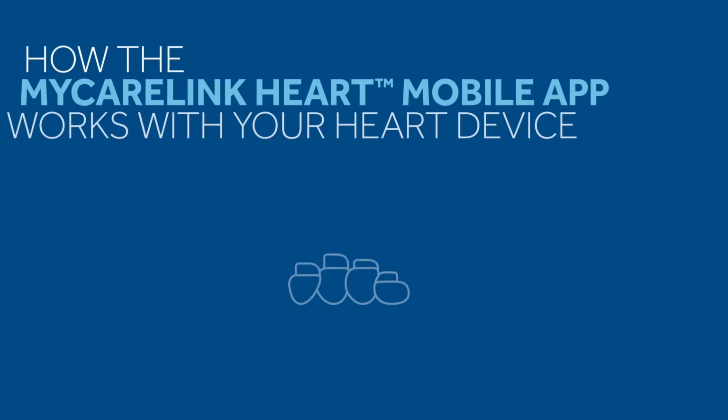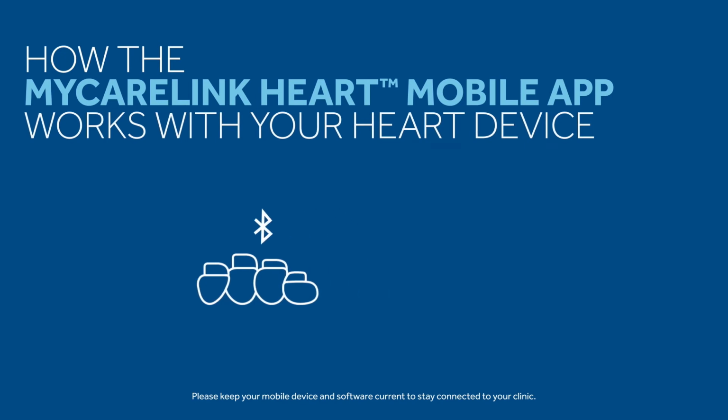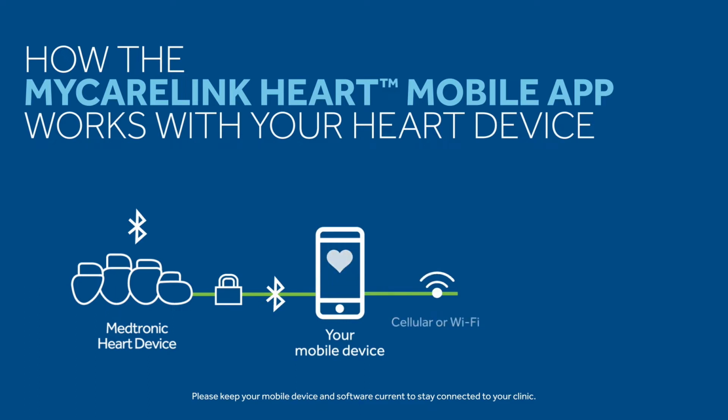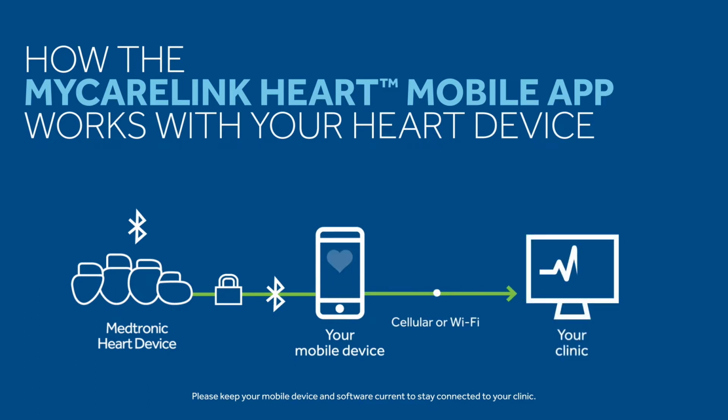Your heart device can communicate directly with the MyCareLink Heart mobile app on your smartphone or tablet. MyCareLink Heart lets you stay connected to your clinic, providing you peace of mind and freedom so you can continue to live your life uninterrupted.